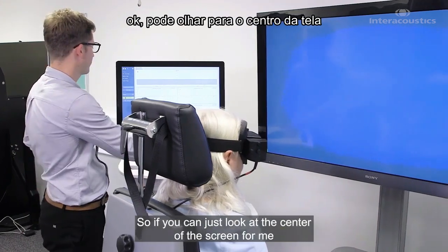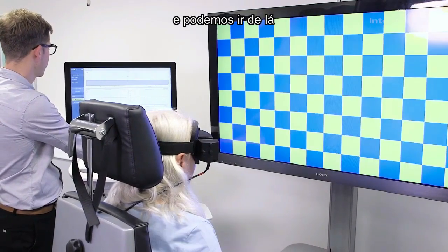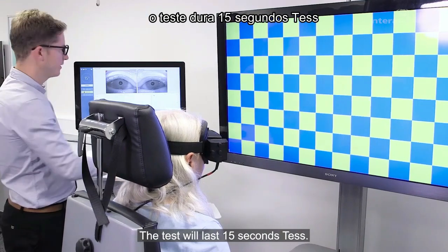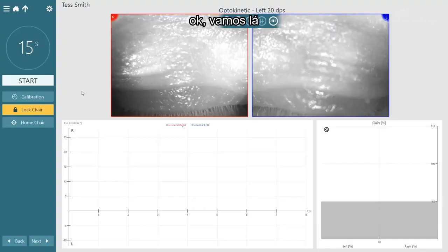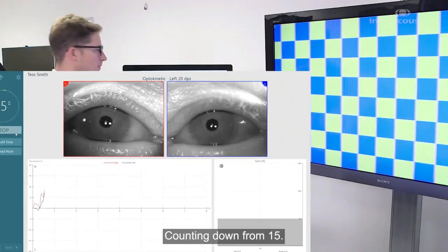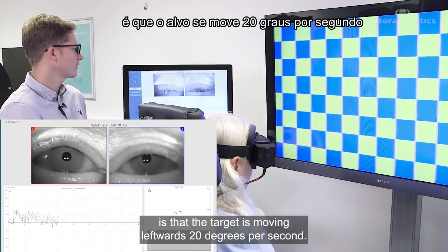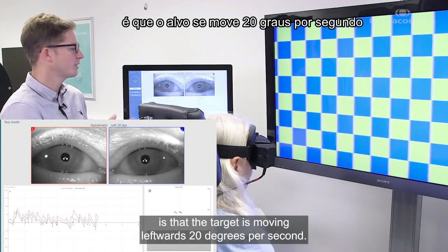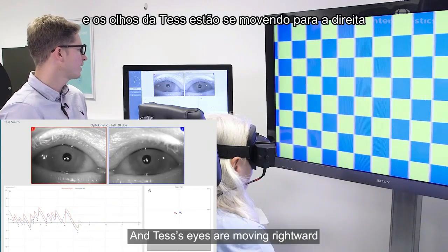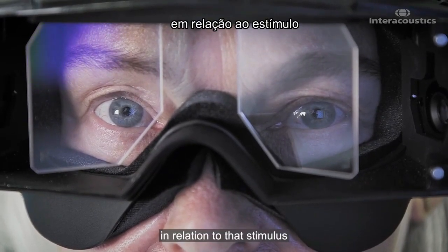If you can just look at the center of the screen, the test will last 15 seconds. What we can see on the screen is that the target is moving leftwards at 20 degrees per second, and Tess's eyes are moving rightwards in relation to that stimulus.